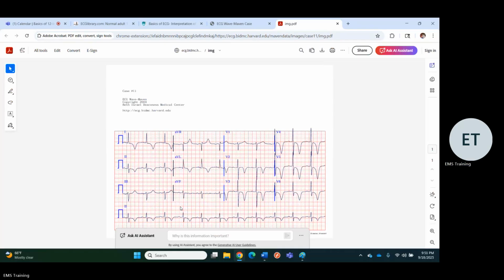Cerebral. Having Wellens in multiple areas of the heart is uncommon. Could this be a reperfusion? Maybe. That is very deep. This is probably an unresponsive person. This looks cerebral, but it's normal there. I have seen Wellens down here before, but it's not really located in congruent areas of the heart.